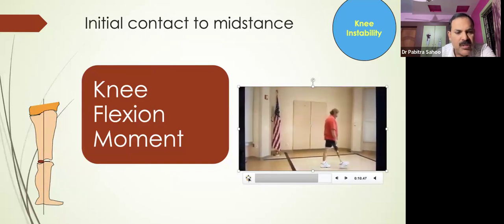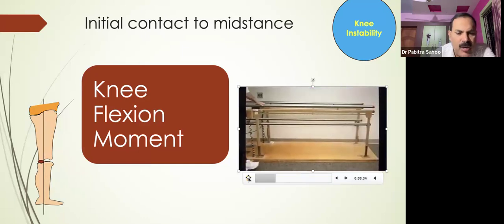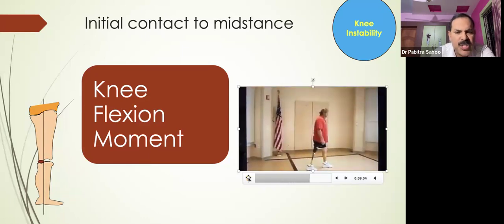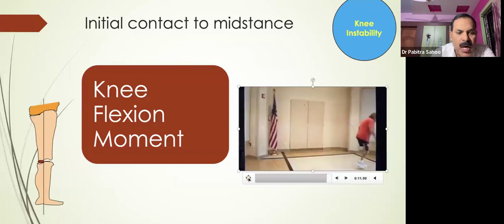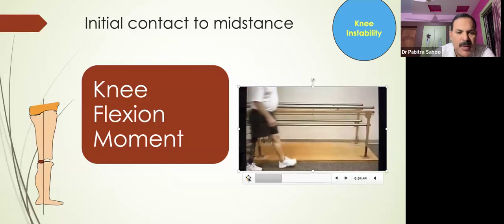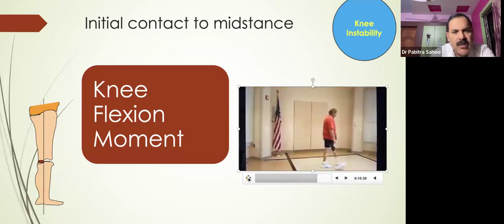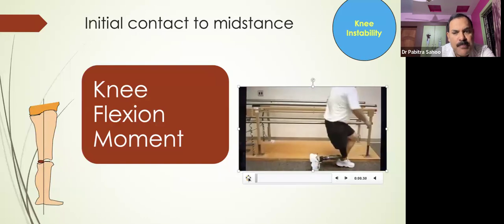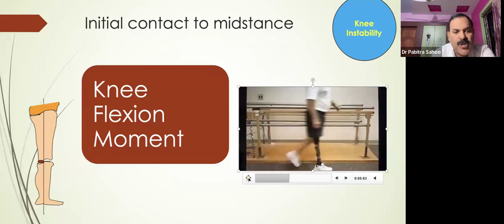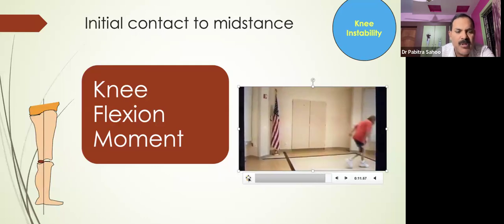So in that situation, look for the position of the knee joint; it should always be posterior to the TKA line. The next thing that can give rise to this type of knee buckling is a too hard heel cushion. Normally, why do you use a SACH foot? A SACH foot has a cushion heel which simulates plantar flexion. Once the patient goes for a heel strike, the rubber in the heel area gets compressed, and that simulates plantar flexion. If the heel is too hard, there is a sudden dropping of the foot, and either the limb will rotate or there will be a sudden buckling of the knee.